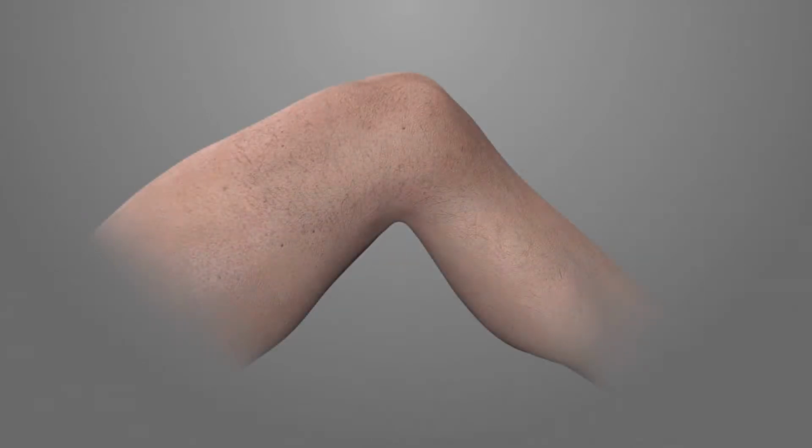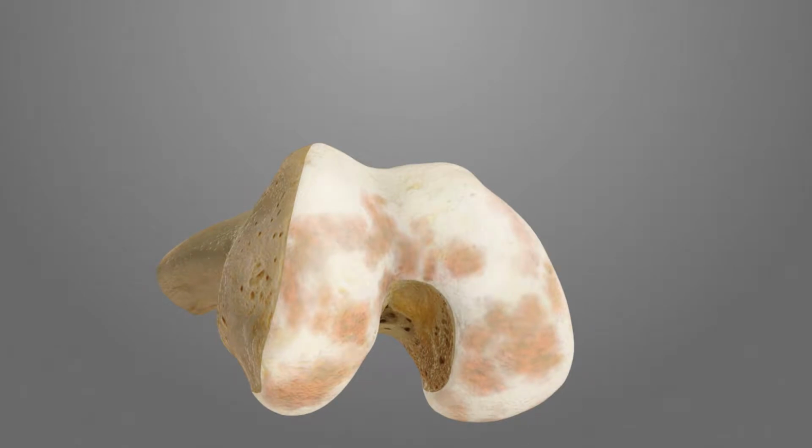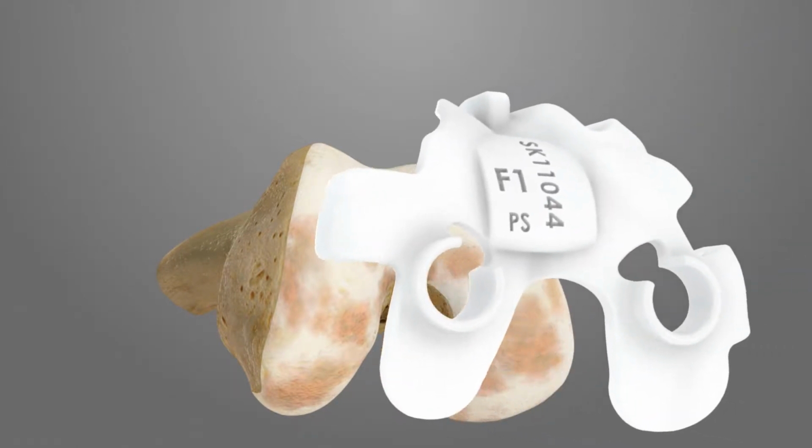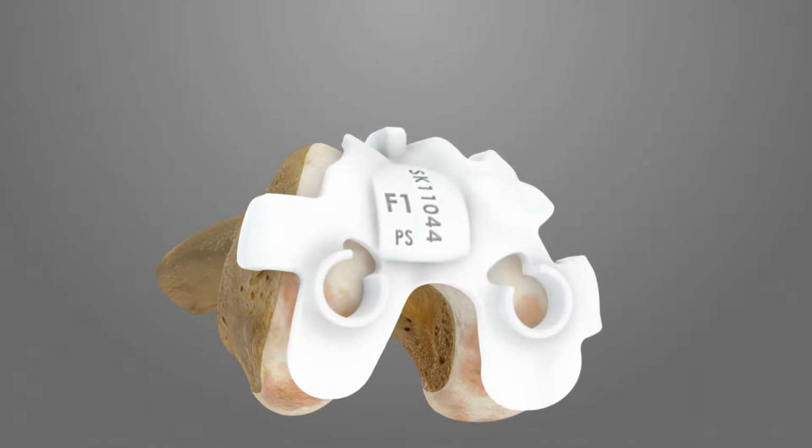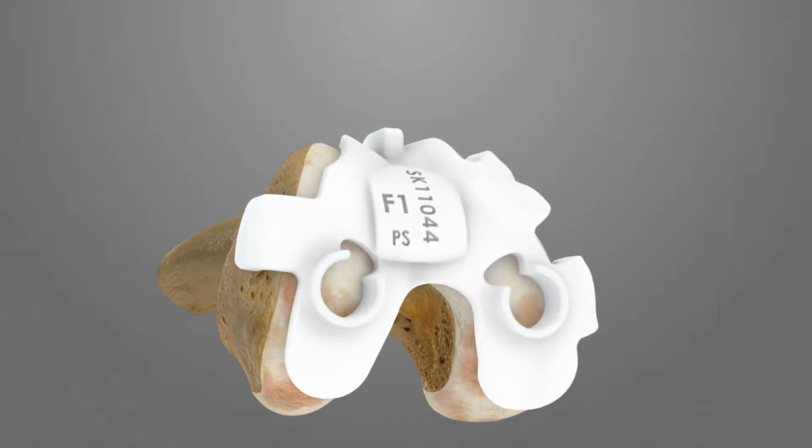Position the patient on an operating table with the leg resting on a foot support at approximately 90 degrees of flexion. After a straight midline skin incision, prepare a medial parapatellar arthrotomy. Place the positioning iJig F1 on the femur so it finds its natural conforming location. This iJig is designed to reference osteophytes and will secure firmly onto the femur.